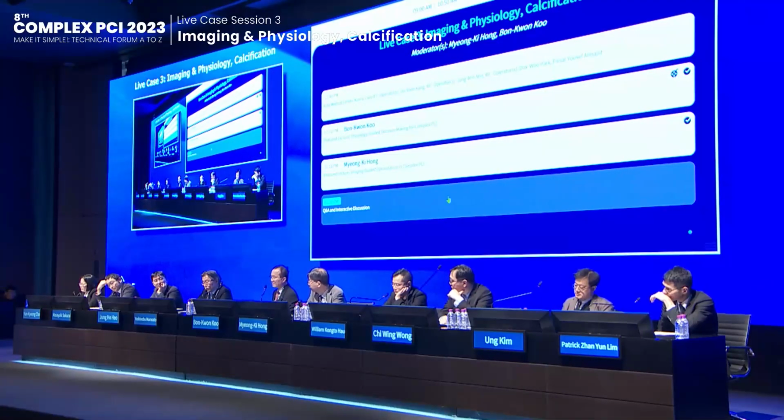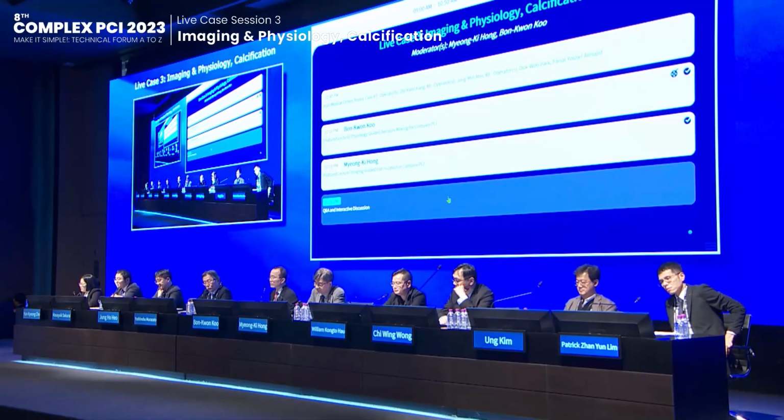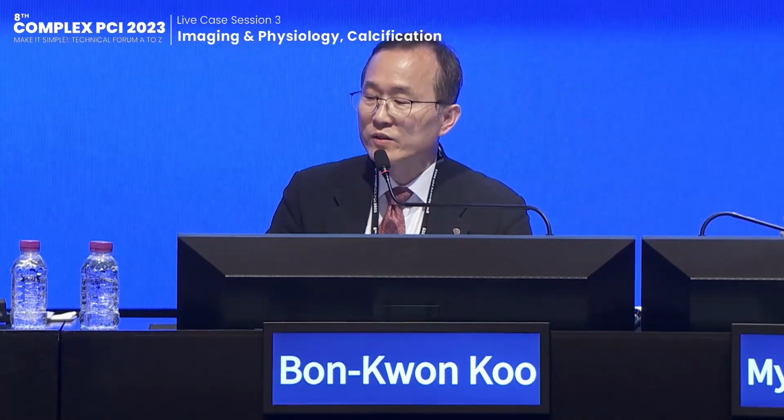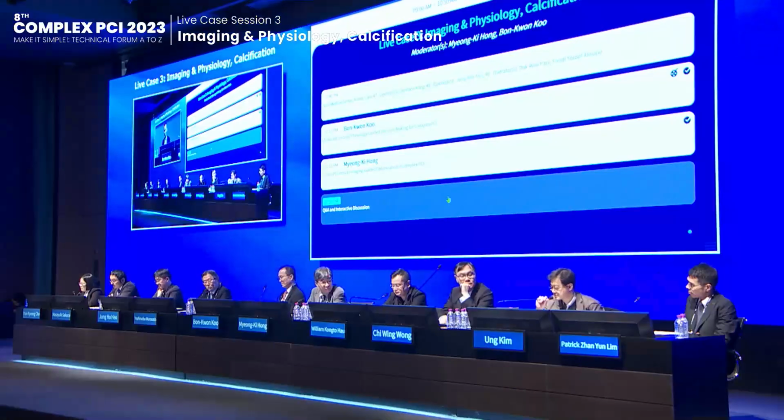How about the QFR? Because these days the QFR is at a starting stage of being adopted in everyday clinical practice. What's your opinion about the QFR? Yes, angio-derived FFR works. We're going to have a simpler version of QFR as well. But I still have some doubt about complex lesion subsets such as bifurcation, left main, and long diffuse lesions. For a simple lesion, I think it's fine, because we have data supporting that it's better than angio-guided. And we'll soon have a comparison between QFR versus invasive physiological assessment, so things will be much clearer then.